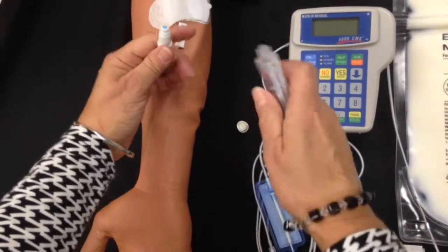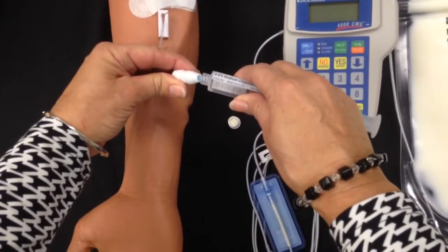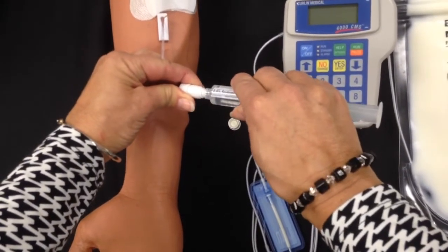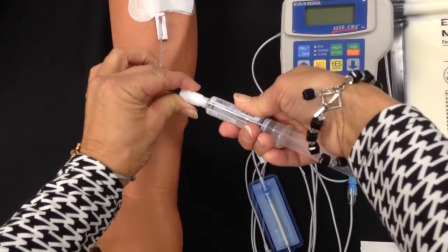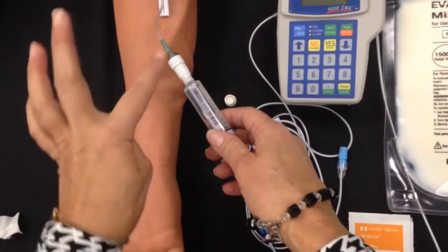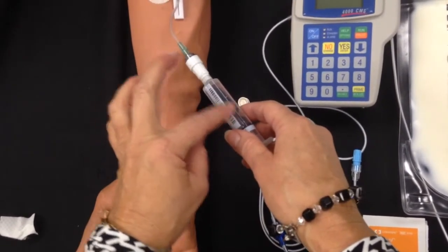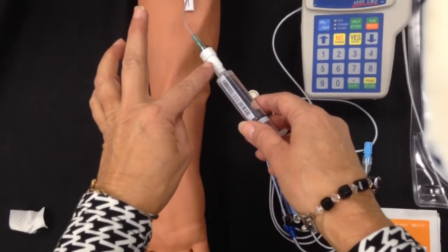Remove the cap, line up the two ends, and push while you twist. If the syringe pops off and you've touched any other surface, you'll need to get a new syringe and re-alcohol wipe the injection cap.